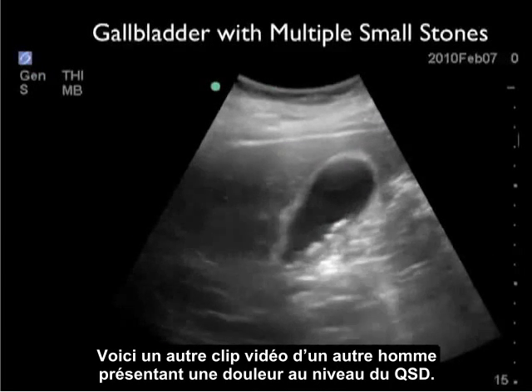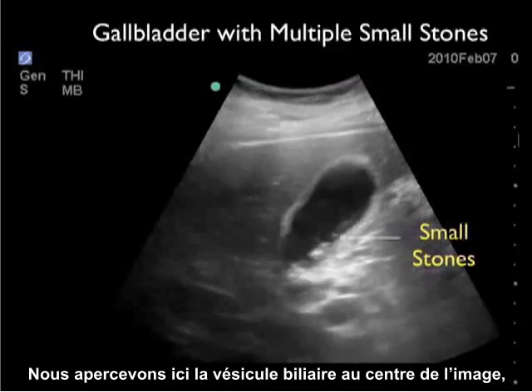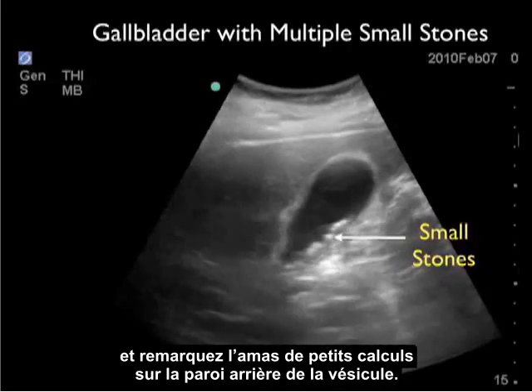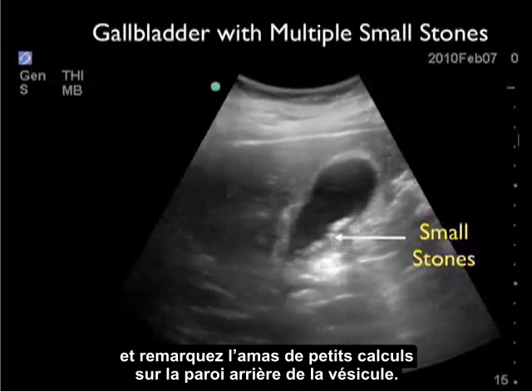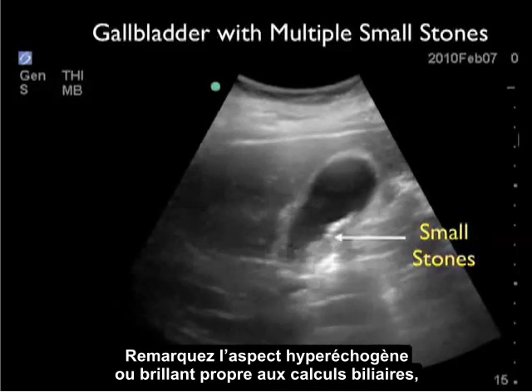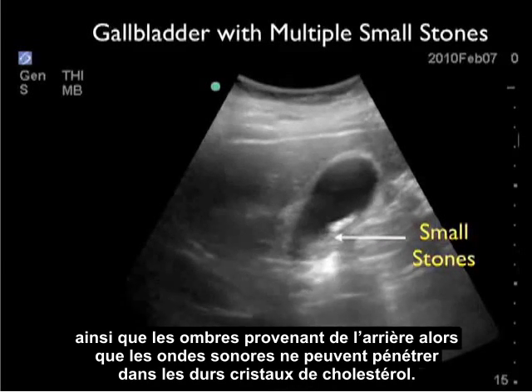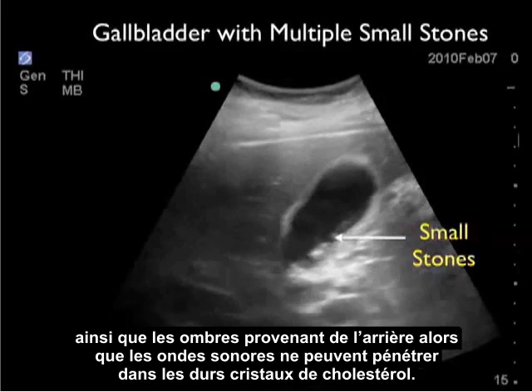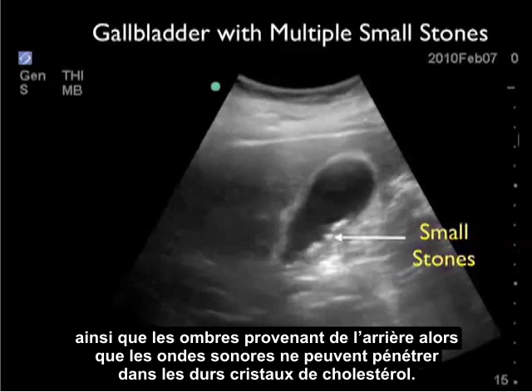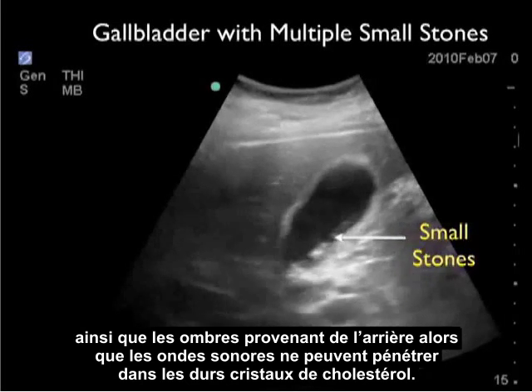Here's another video clip, again from a male presenting with right upper quadrant pain. We see the gallbladder in the middle of the image, and notice the layering of multiple small stones on the back wall of the gallbladder. We see the characteristic appearance of a gallstone: it has a hyperechoic or bright appearance, and we can see shadows coming off the back as the sound waves can't permeate the hard cholesterol crystals.